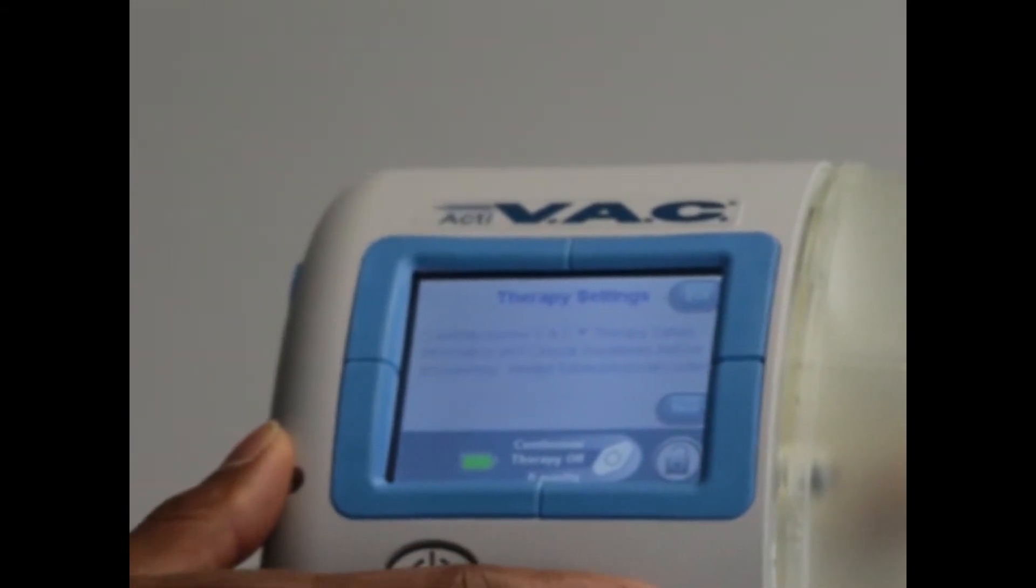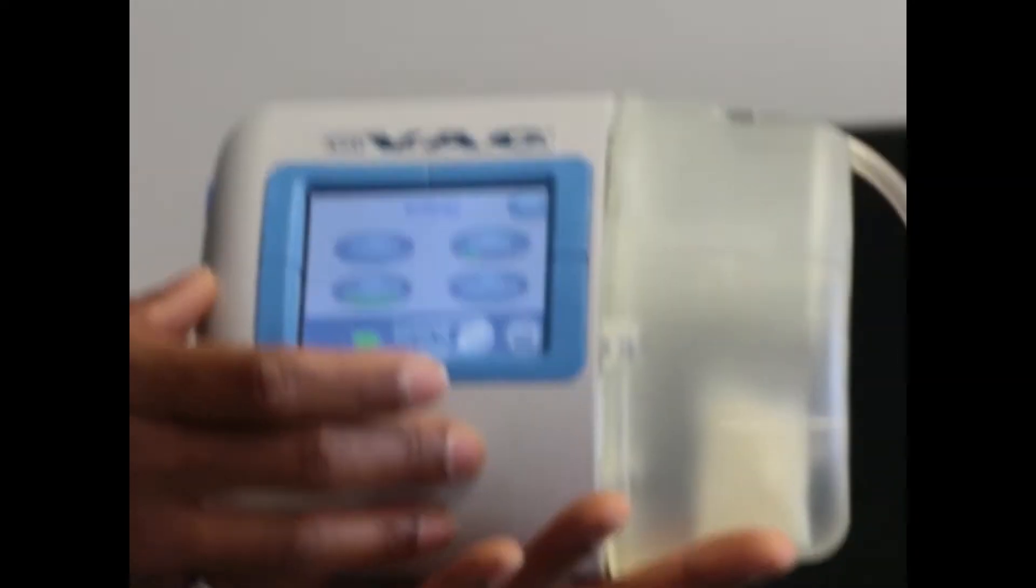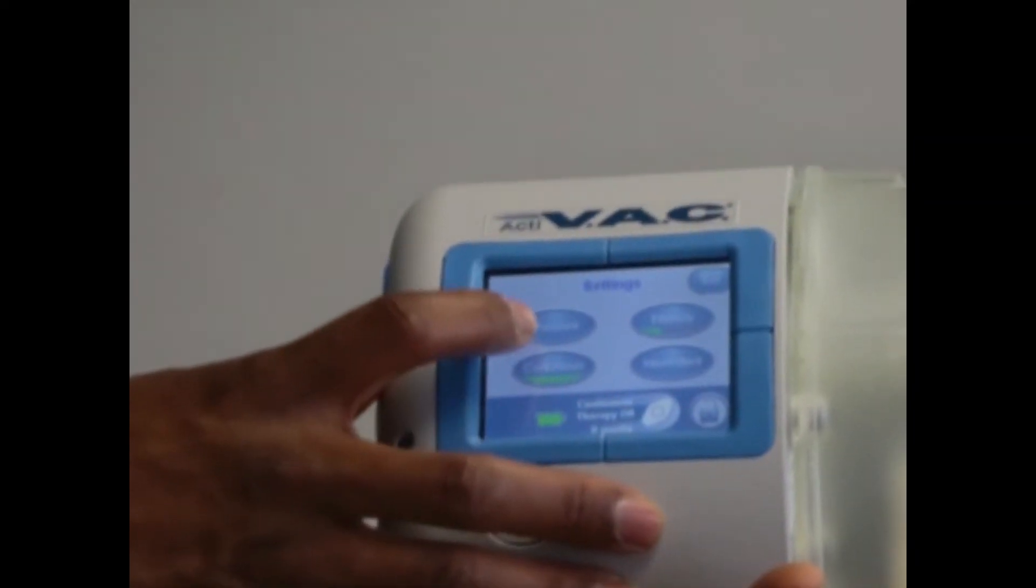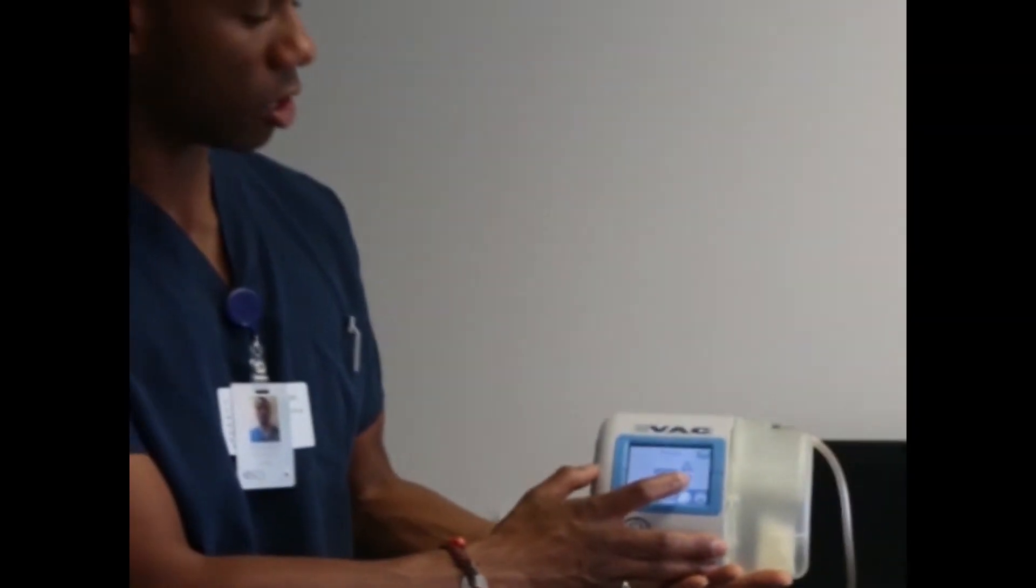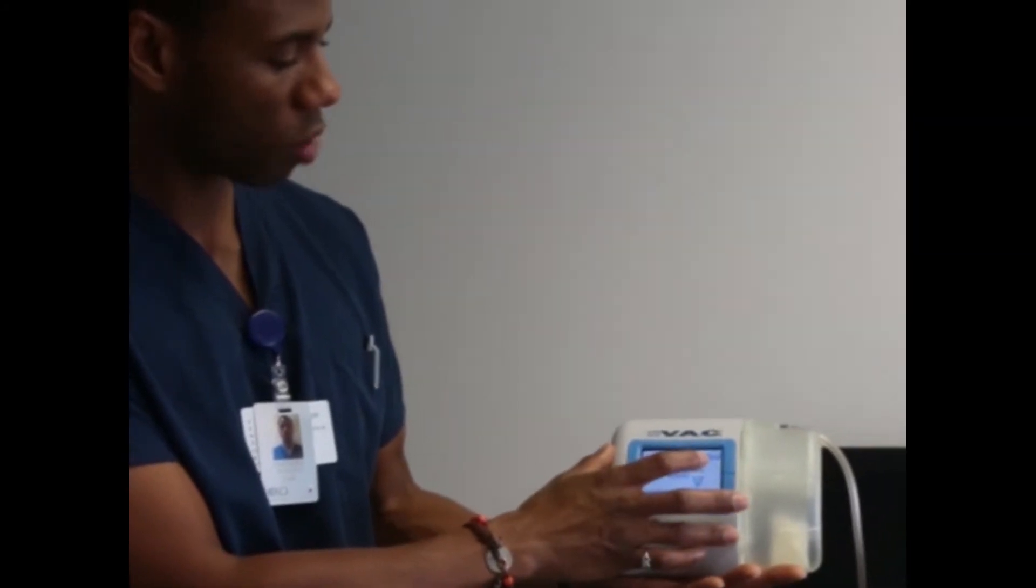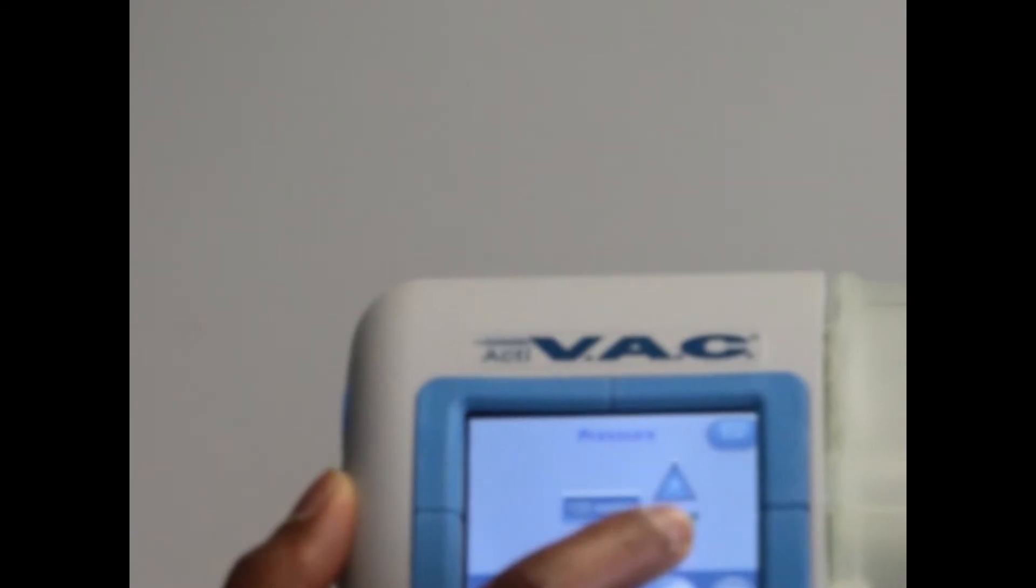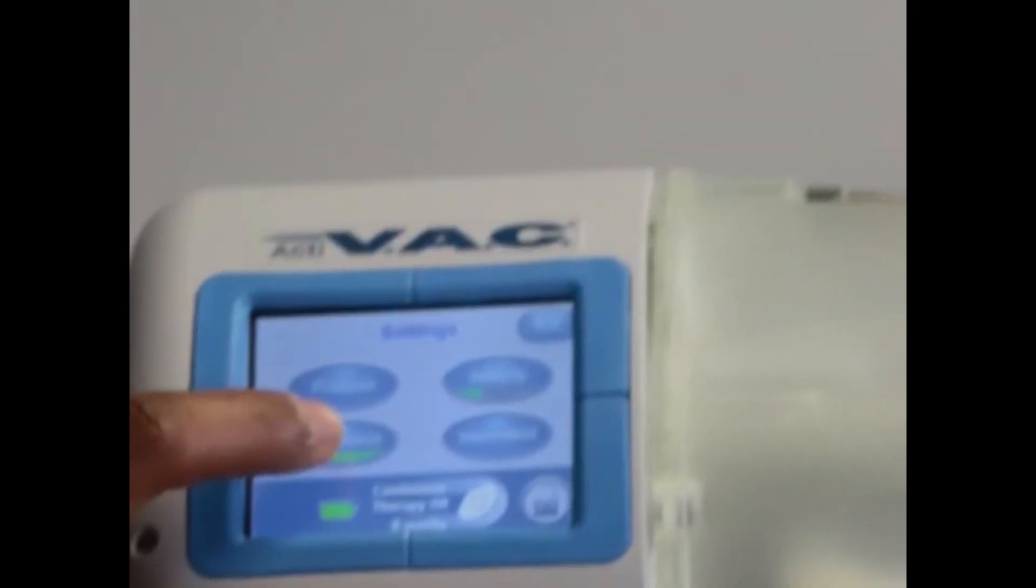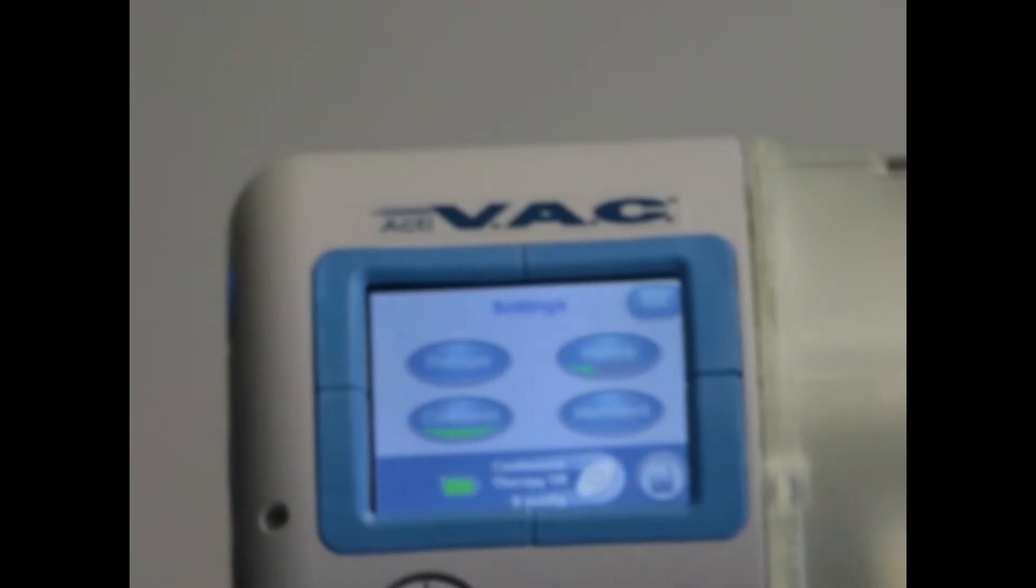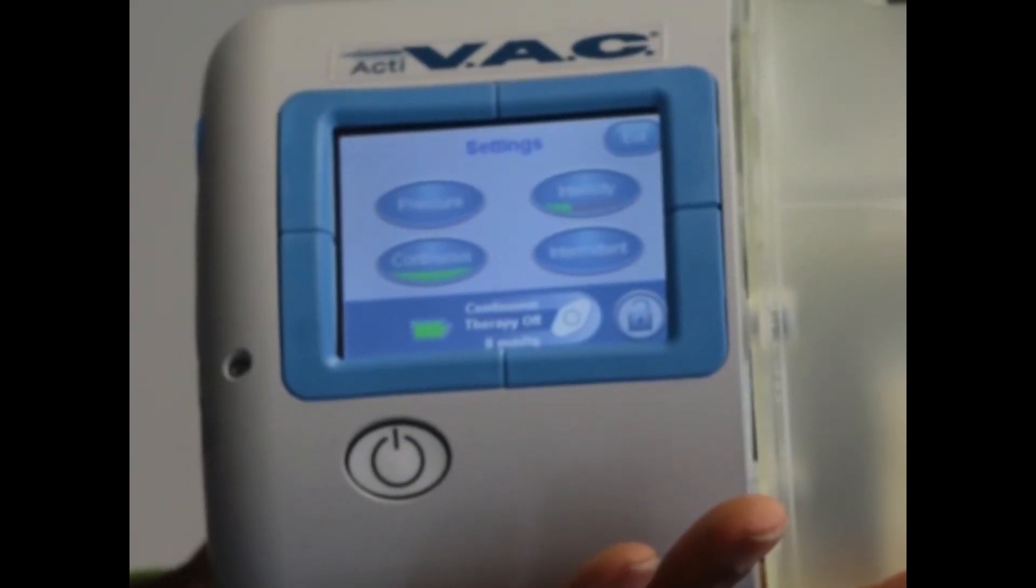Exit out of that. And then the main thing is going to be in your therapy settings. So it just gives you some information. You can click next. Settings is where you can adjust your pressure. So this is probably one of the main areas you're going to go to, depending on what the physician has prescribed for the patient. 125 is the normal or basic that most are prescribed at. It goes up to 200. And you just use the up and down, plus and minus click arrows, all the way down to 25 millimeters of mercury for pressure. So we'll leave it at 125. It connects it out.